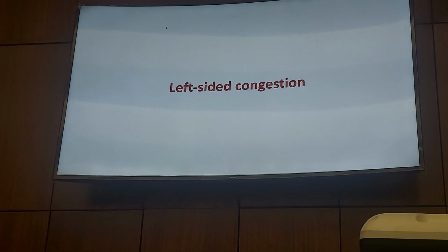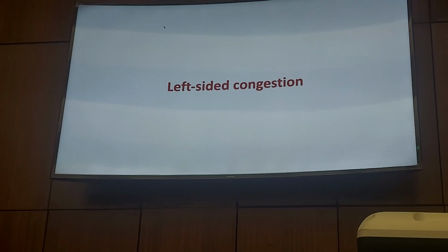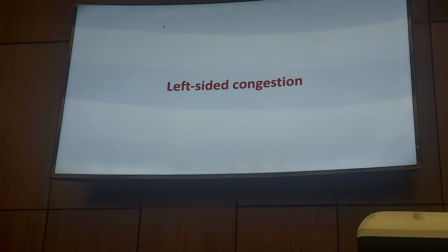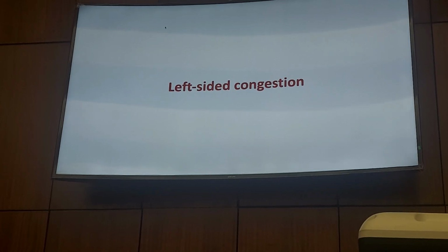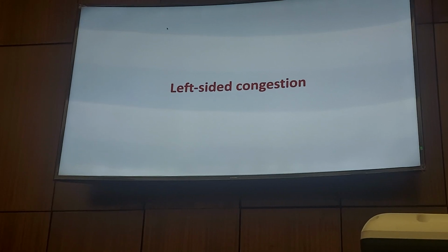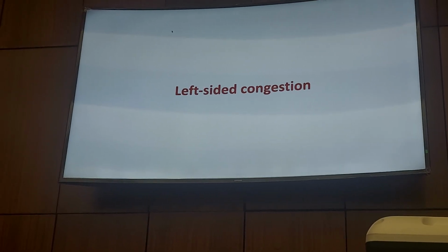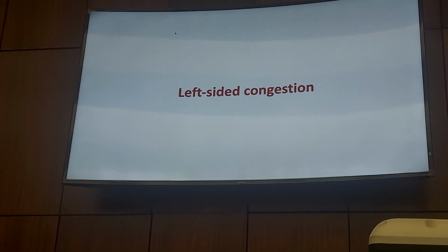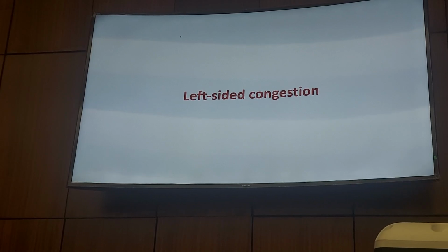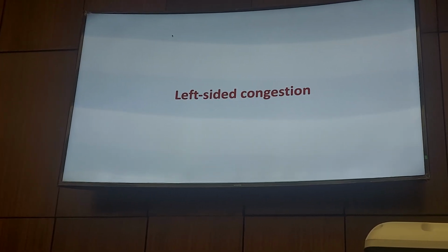Sure. Thank you very much, Dr. Mahmoud. The first question is the abdominal pressure. You are very unlikely to affect the interpretation of hepatic, portal, and renal veins with intra-abdominal pressure elevation unless it becomes a significant elevation, and we don't see that commonly in our patients, unless you have abdominal compartment syndrome, which is not common. How many patients with compartment syndrome do you see in your cardiac practice? Very few. Even in my cardiac ICU, I don't see a lot of these patients. But the IVC will be affected, definitely. That's why IVC alone is not enough.